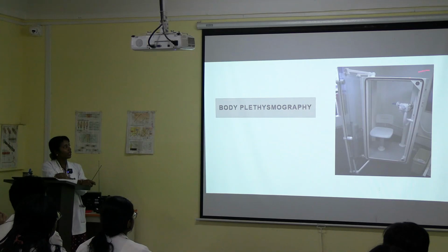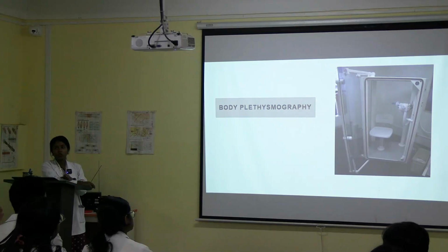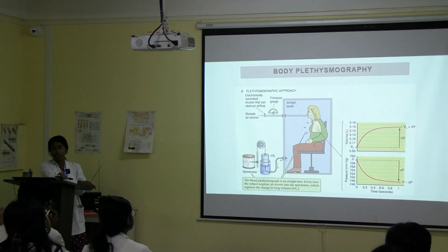Okay, this is an airtight chamber, the person will be sitting here. Then the door will be closed. Then you will be breathing through a pneumotachograph from here, that is called a pneumotachograph.